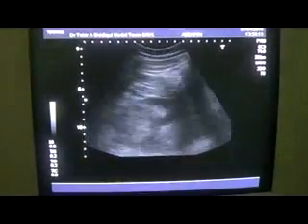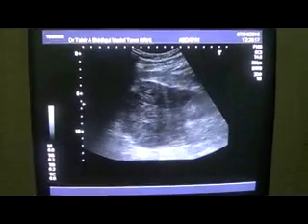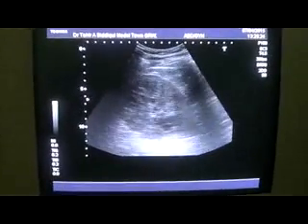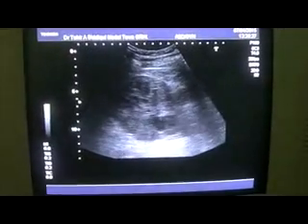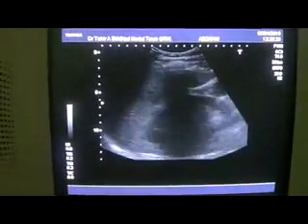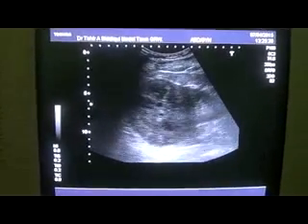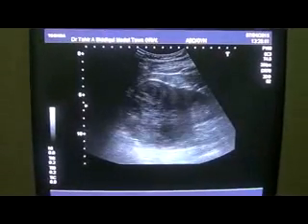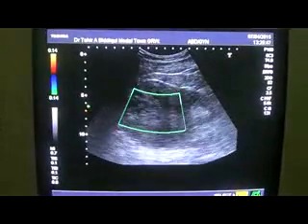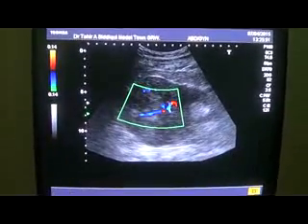And the main pathology once again, that relates to the upper and mid region of the right kidney, is a solid mass, heterogeneous in appearance, cystic and solid, with multiple internal cystic areas, expanding the capsule of the kidney, moving with the kidney, gliding over the quadratus lumborum muscle. It is showing vascularity. This is a case of renal cell carcinoma, unless proven otherwise. Thank you very much.